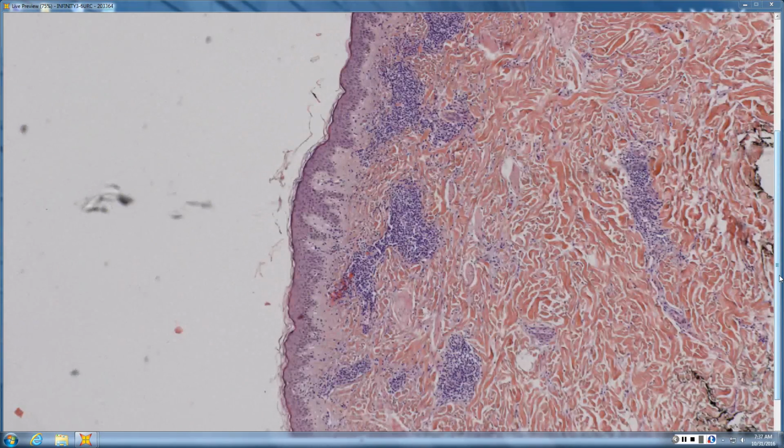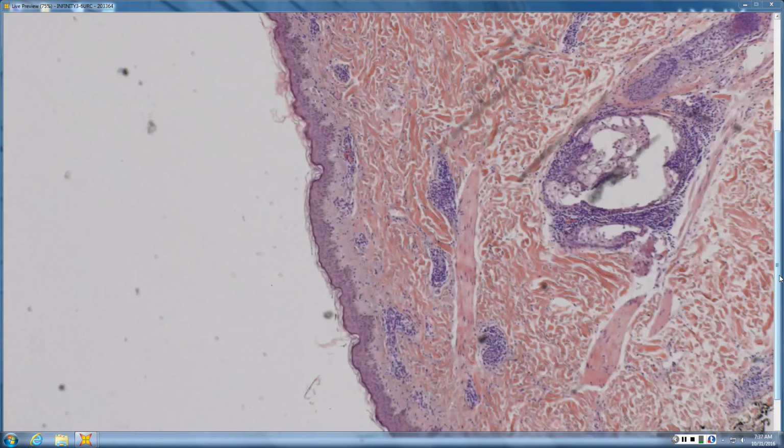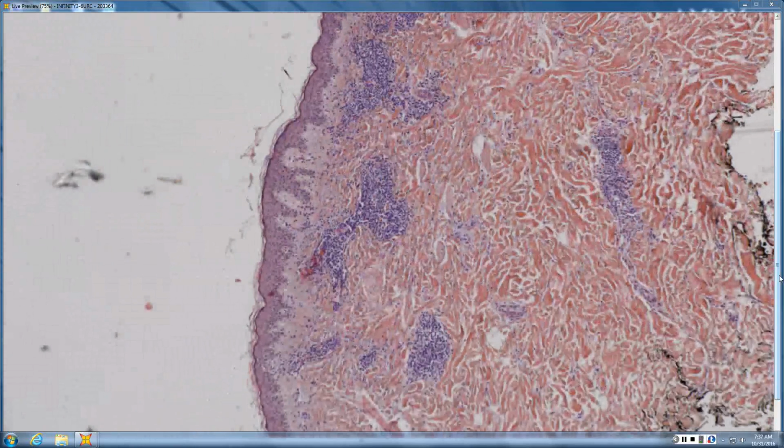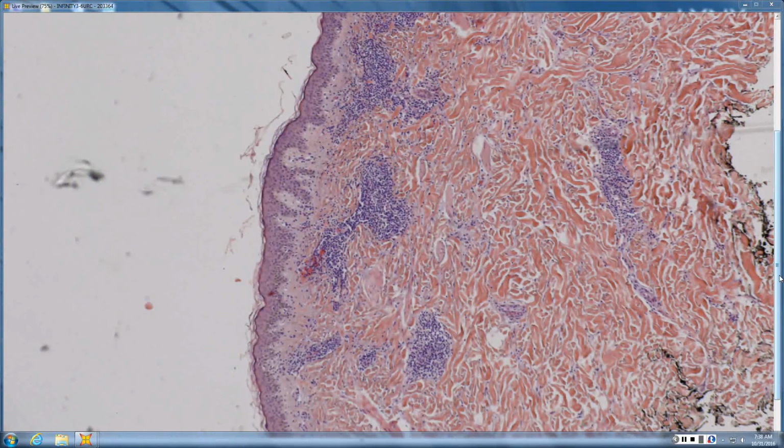That looks like a paintball. It looks like we could have a little EAC on our hands here. Could be EAC, absolutely. In EAC you tend to have a focal spongiotic process with parakeratosis, but gyrate erythema is absolutely in the differential because you're seeing a perivascular lymphoid infiltrate that's pretty tight.